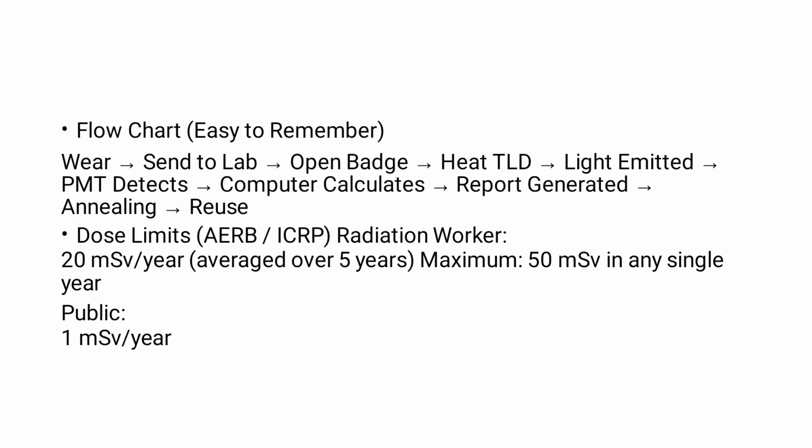Next, the TLD chips are heated in the TLD reader, and from there light is emitted. Next, what happens? The PMT detects this light and this is sent to the computer, which calculates the dose. Next, the reports are generated in paper format, and then finally it is sent to the RSOs, and AERB also maintains a record of the doses. Then the annealing process happens again at 400 degrees centigrade, and the badges are made reusable.